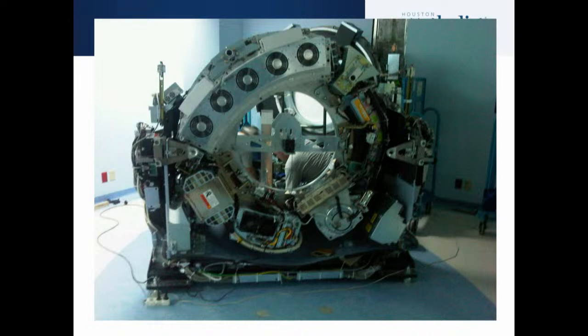So it's called a PET CT system. It's a hybrid system. What does that mean? It has a PET scanner and a CT scanner. A CT scanner is exactly like any other CT scanner that you know about. So it's very similar to the CT scanner that you will hear about, I think, in a couple weeks. And it can usually be attached to anywhere from 8 slice to 64 slice or higher CTs. Now we're going to focus today on the PET part.